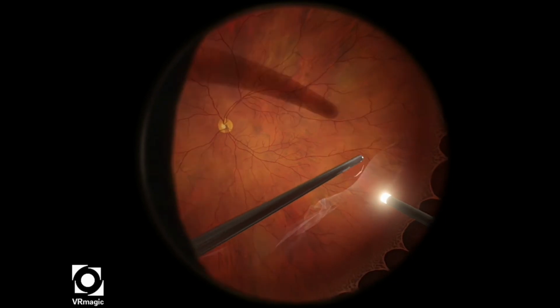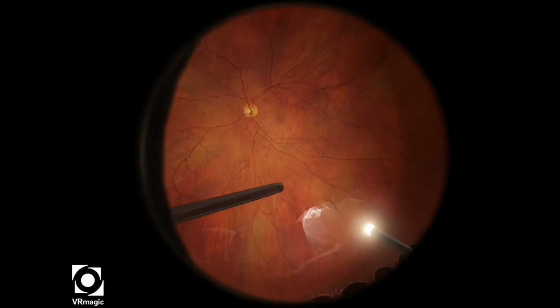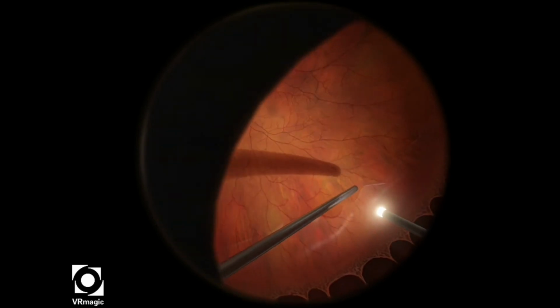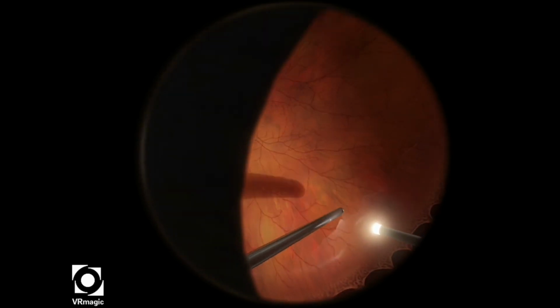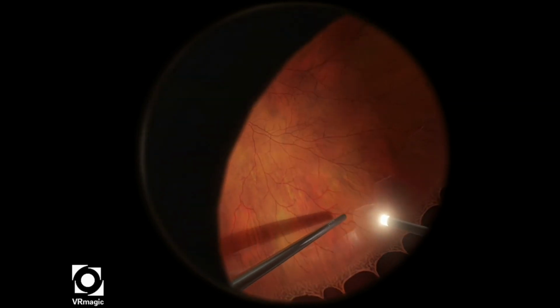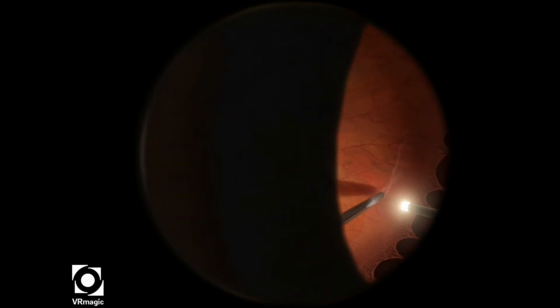Like I've mentioned in the previous video, the area underneath the light pipe is the hardest. Try to raise your light pipe a little bit more anteriorly so that your cutter has space underneath, and also try to be as close as possible to the ora serrata. I know it's hard because sometimes the machine will detect that as you coming out of the eye of the light pipe and your vision will go black, like just what happened right there, but you do want to be able to visualize what you're cutting underneath that section.